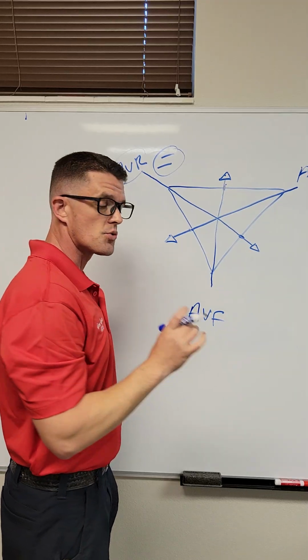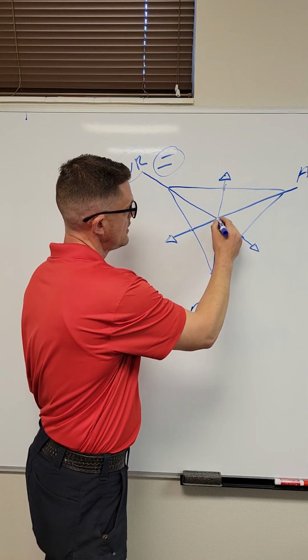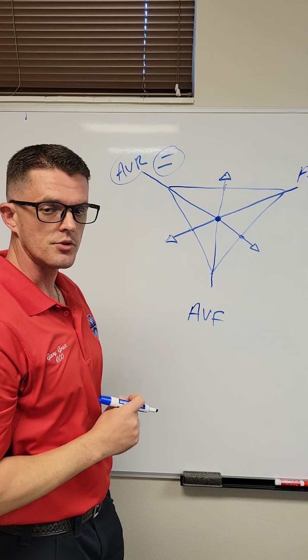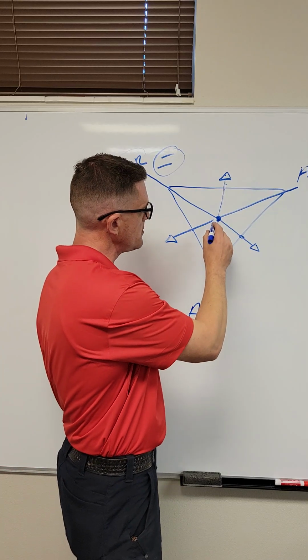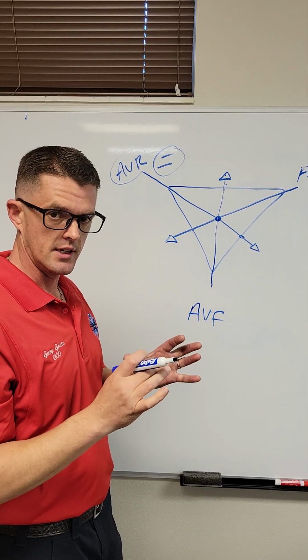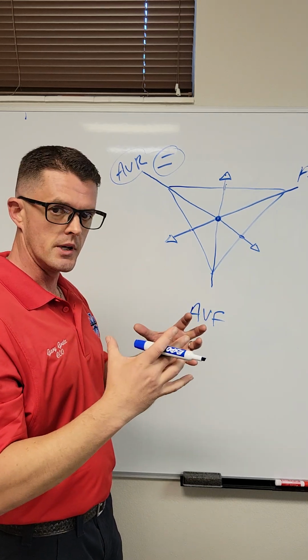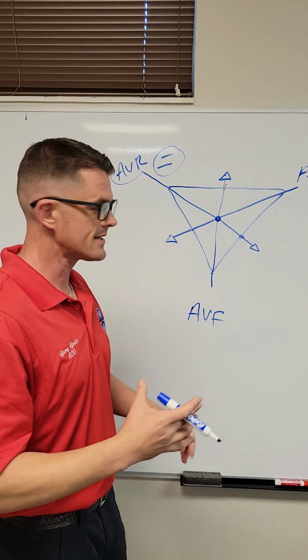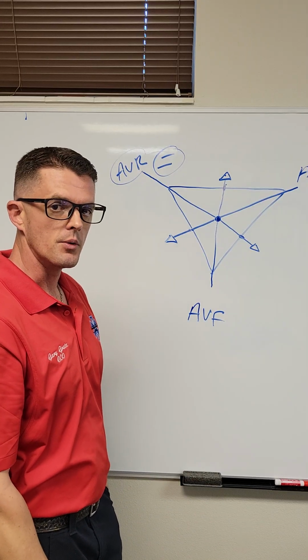But what's really cool about this is once it has created all this, it creates a central point. That's the Wilson Central Terminal. What's really neat about that is it has now created the ultimate negative. So now we can take additional leads. Now I can take this and go from a two-dimensional view to a three-dimensional view. And now I have precordials that I can add to this that can all focus their view on this wonderful central point that we've created.